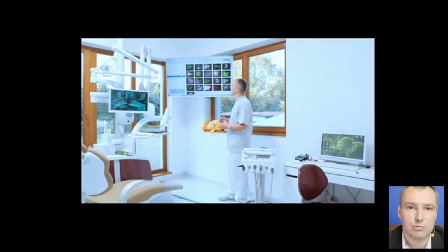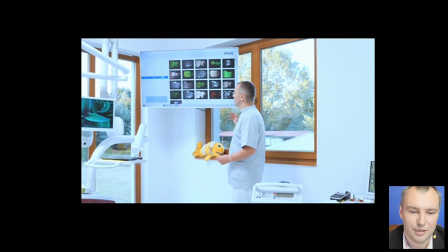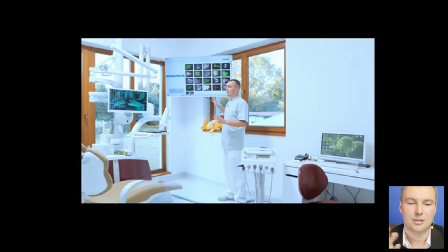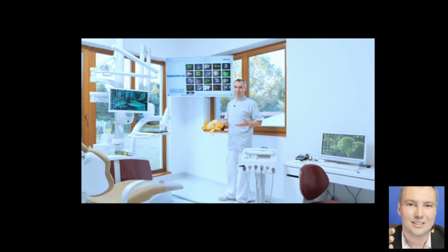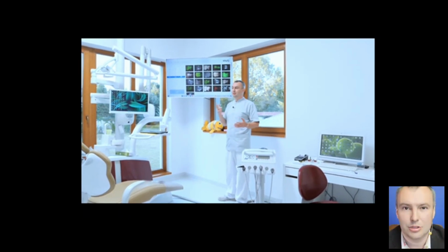Actually, when I was organizing this room, the first thing I decided was where the TV would be placed. Only then did I decide how to place the dental chair so the TV can be seen by the patient. This is the central device for the patient. From this point I can show the patient everything on a large screen and explain everything. I use it for DiagnoCam images, for tomography or CBCT images, and so on.